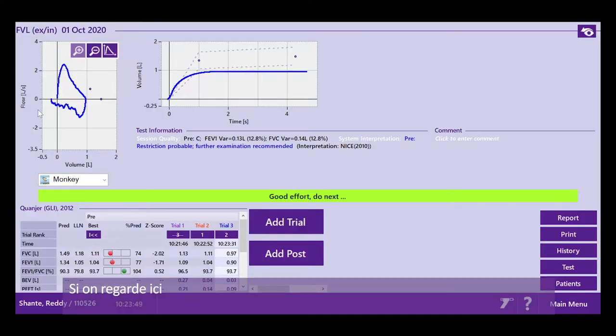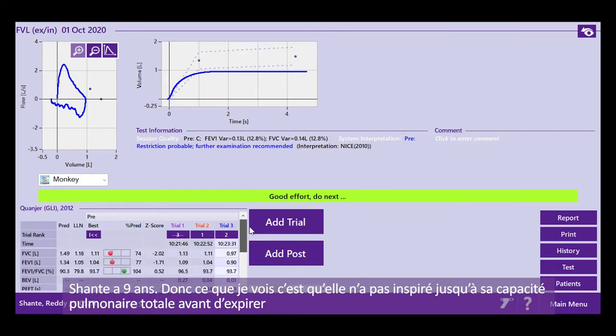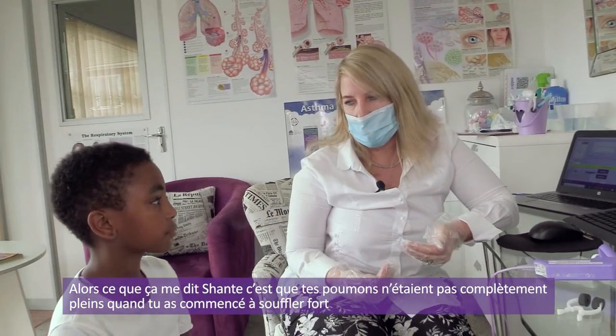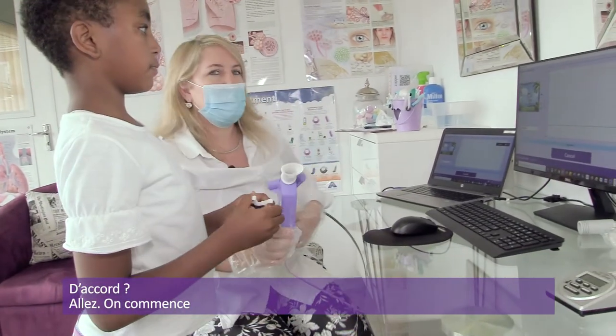So if we look here, what we can see on the screen is that the inspiratory portion of the curve was a lot bigger than the expiratory portion. So what I'm doing now is I'm looking at the FVC, which on this blow was 0.97, and I'm looking at the FIVC, which was 1.16, and it's outside of the repeatability criteria. Shanti is 9 years old, so what I'm seeing is that she did not breathe into total lung capacity before she blew. So what that's telling me, Shanti, is that your lungs weren't as full as they could be before you started to blow. So I want you to make sure that your lungs are full before you blast the air out. Okay, good. All right, let's give it a try.